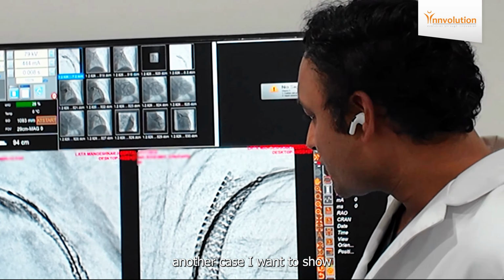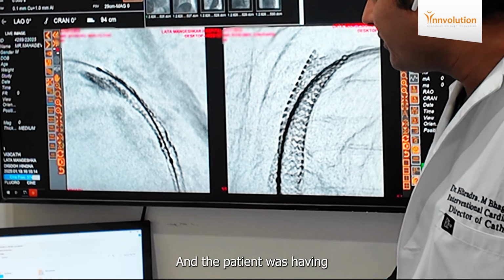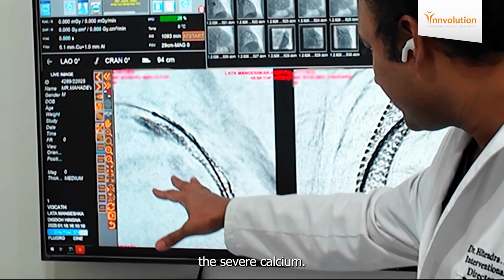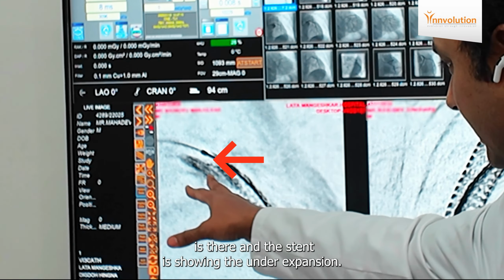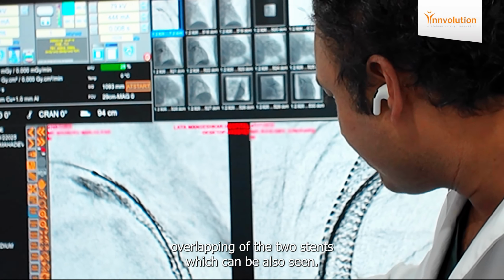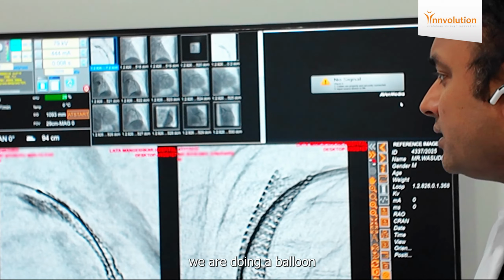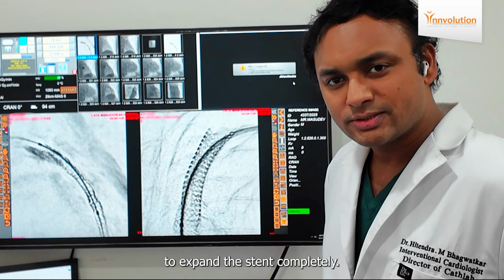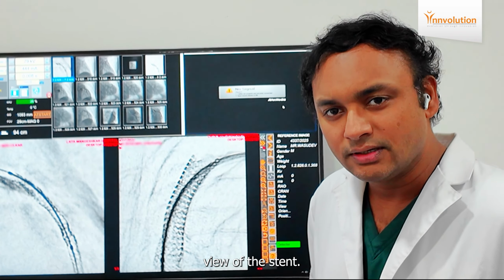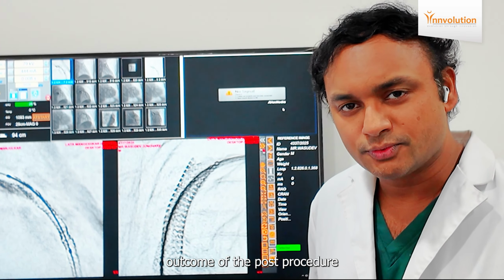Another case I want to show is a coronary artery stenting, where the patient had a severe calcific lesion. You can see that in some parts severe calcium is there, and the stent is showing under-expansion. There is an overlapping of two stents which can also be seen, and now in the procedure we are doing a balloon expansion where we try to expand the stent completely. So from the stent clarity we get a much better view of the stent, which is an advantage for a better post procedure outcome.